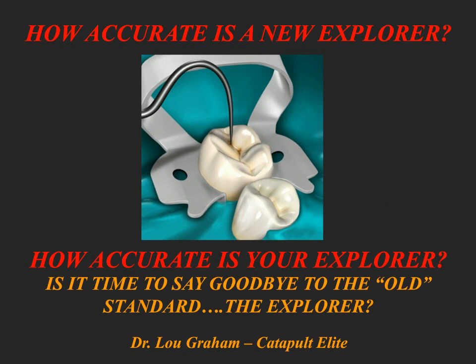So let's think about it for a second. How accurate is a new Explorer? How accurate is your Explorer? After an Explorer has been sterilized numerous times, how sharp is the point of that Explorer? Or is it really a blunt probe? Can we really tell if there's active caries in a pit and fissure with a sharp Explorer, let alone one that's been sterilized numerous times? Is it time to say goodbye to the old standard, the Explorer? This is a quote from Lou Graham, the founder of Catapult Elite.